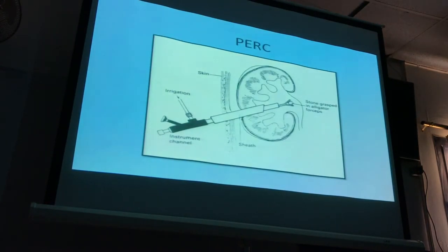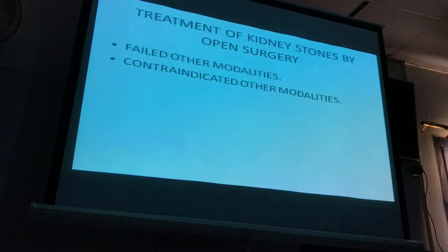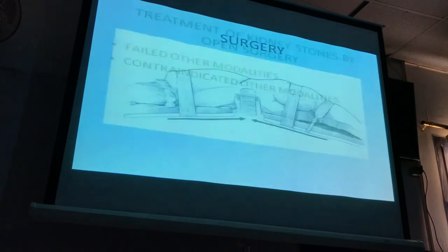A small opening in the skin. Then you will enter by scope inside the pelvicaliceal system, and then with the instrument or with the forceps, you will grip the stone and you will retrieve it out. If other modalities fail, we have only one option, open surgery.